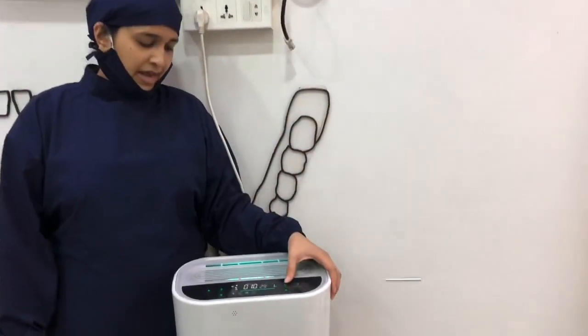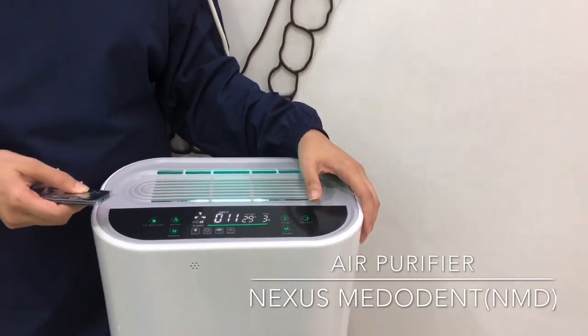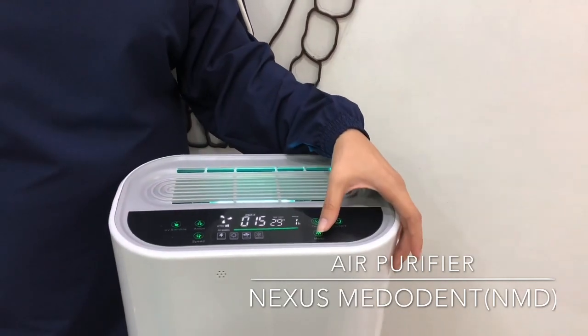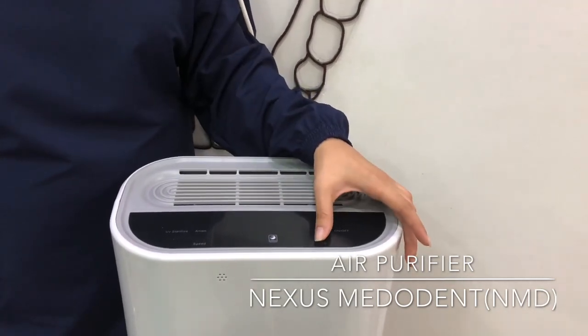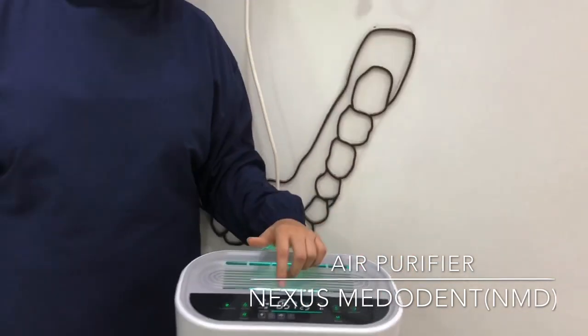It has a timer — up to 12 hours you can set the timer and you can leave the clinic for whatever time, maybe an hour or two hours. It has modes: auto mode, sleep mode where the touch panel will be in a sleep mode, and a normal mode. These are the 3 modes, and as you can see the noise is not that much and the air quality keeps improving.